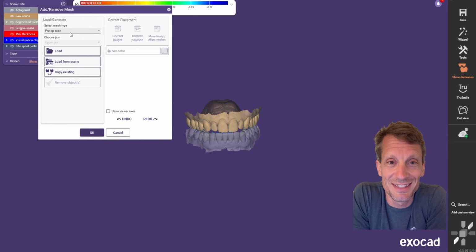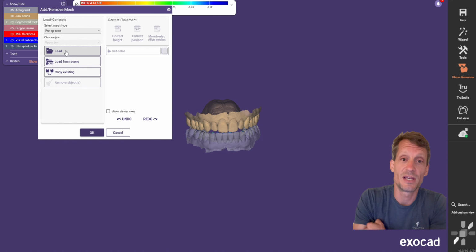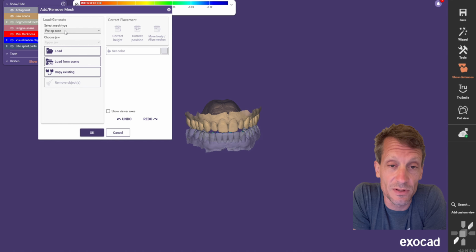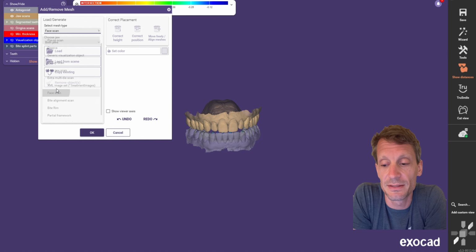While I definitely feel like the anterior determinants of occlusion are probably more important, more impactful, the posterior determinants, condyles, eminences, those things are not to be disregarded. So I'm going to walk you through this case where I did a clone face scan, mounting for a night guard. Night guards, you can look at them as practice runs for full mouth equilibration or reconstruction. And so here we go.